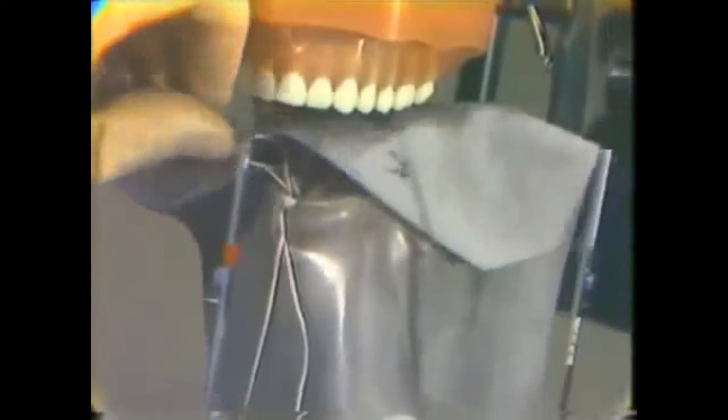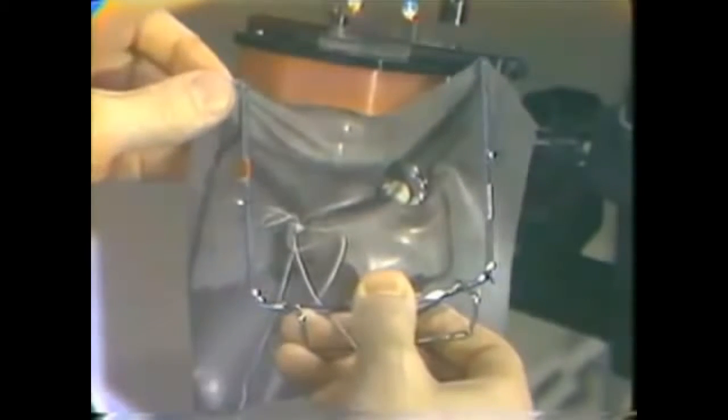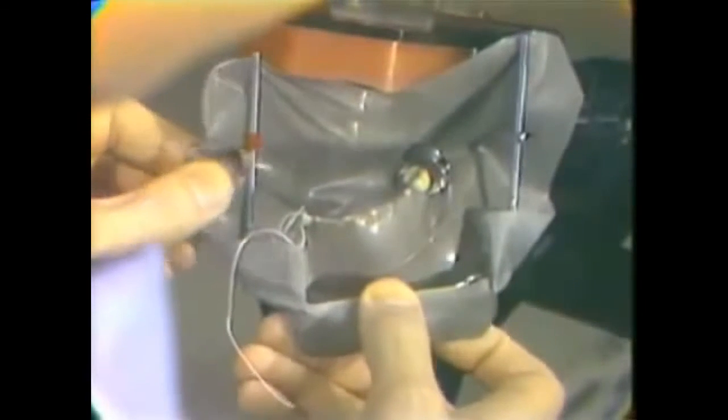Now bringing the rubber dam up and taking the rubber dam frame. The frame will then be positioned, holding and placing the upper ends of the frame first, and drawing the rubber dam over the small pegs on the rubber dam frame. It's merely engaged. These do not penetrate the rubber dam, but merely engage the rubber dam with moderate tension. Now then, the middle pegs are used to pick up some more of the slack in the rubber dam, and just with a small amount of tension, they are held in position.